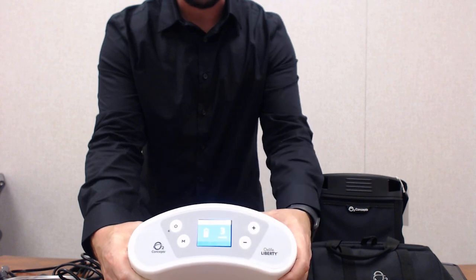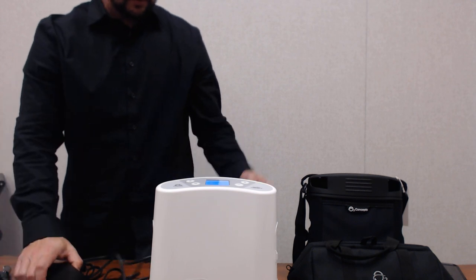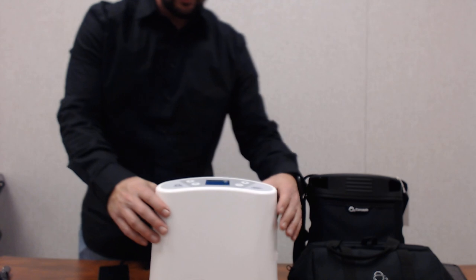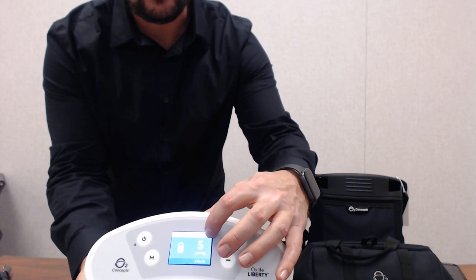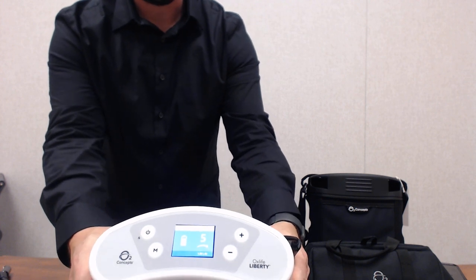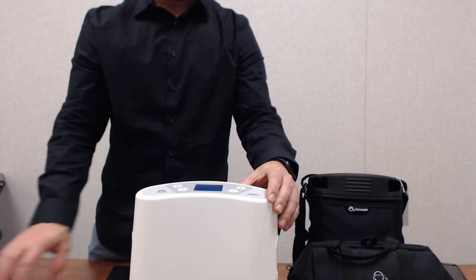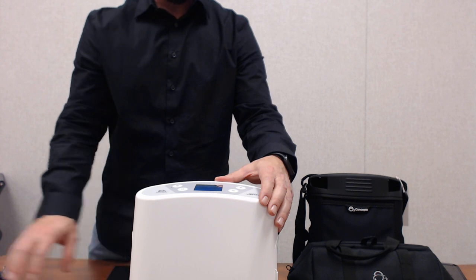On your screen you also have an indicator for your battery. When you plug the device in, you'll see a symbol of a plug at the top and a lightning bolt on the battery icon indicating it is actively charging. A patient can use this device and charge it at the same time on all settings through AC or DC power.